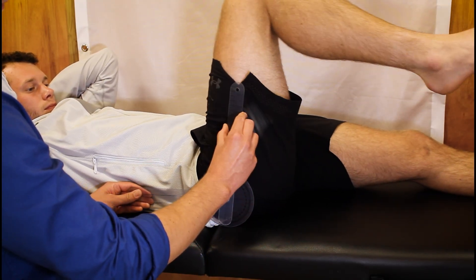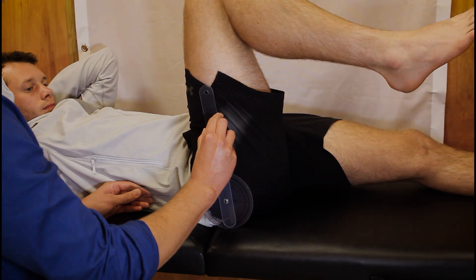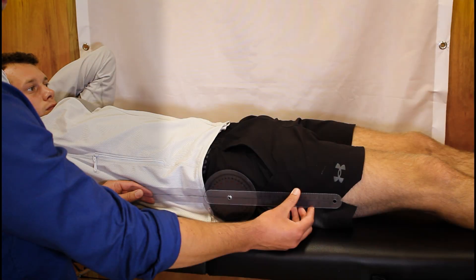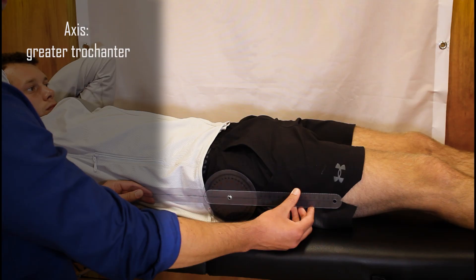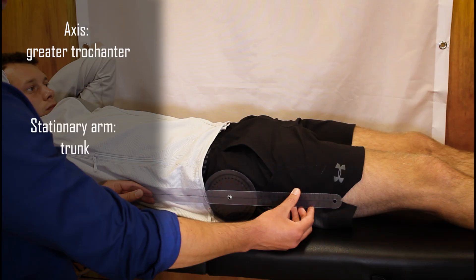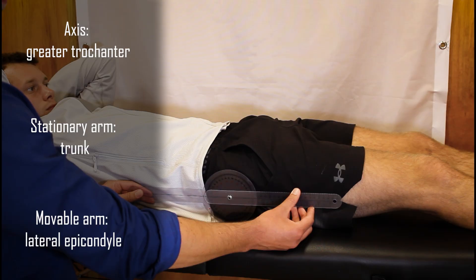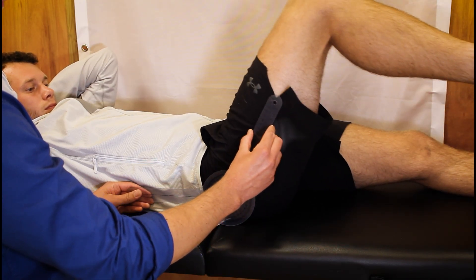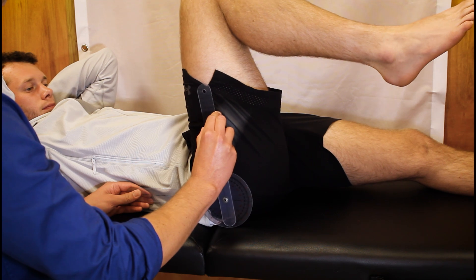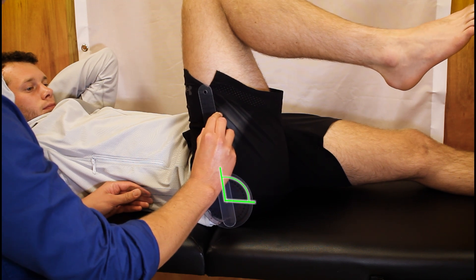To measure hip flexion, the patient is positioned in supine. The axis of the goniometer is placed over the greater trochanter of the femur, with the stationary arm parallel to the trunk and the movable arm parallel to the femur pointing to the lateral epicondyle. Ask the patient to bend their knee towards their chest as far as possible and ensure they avoid lumbar flexion.